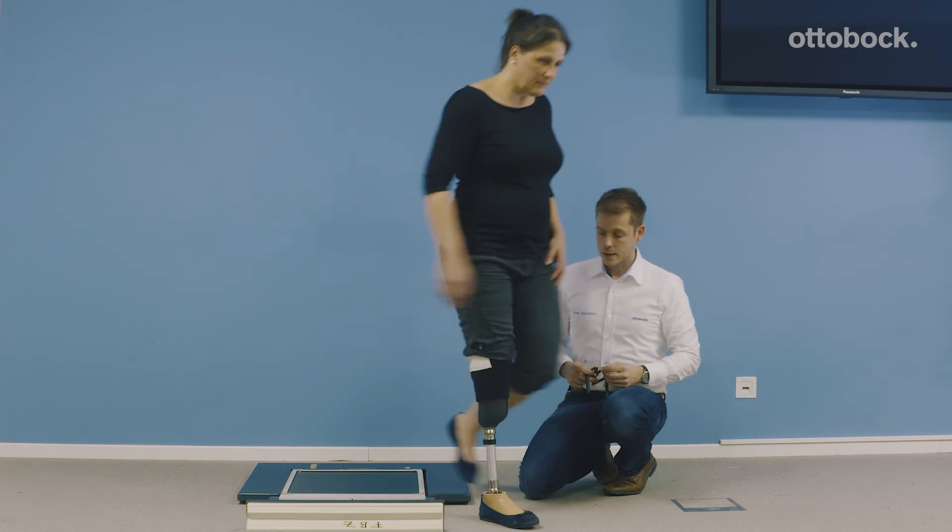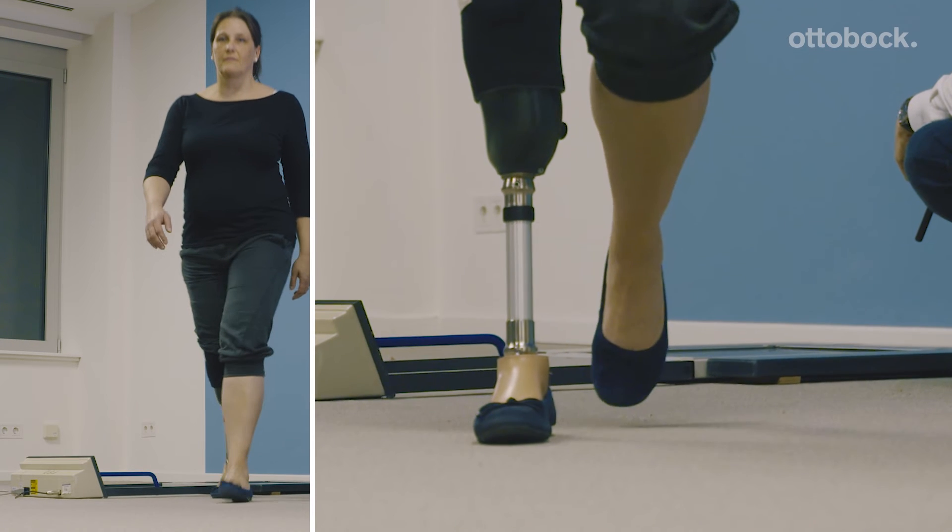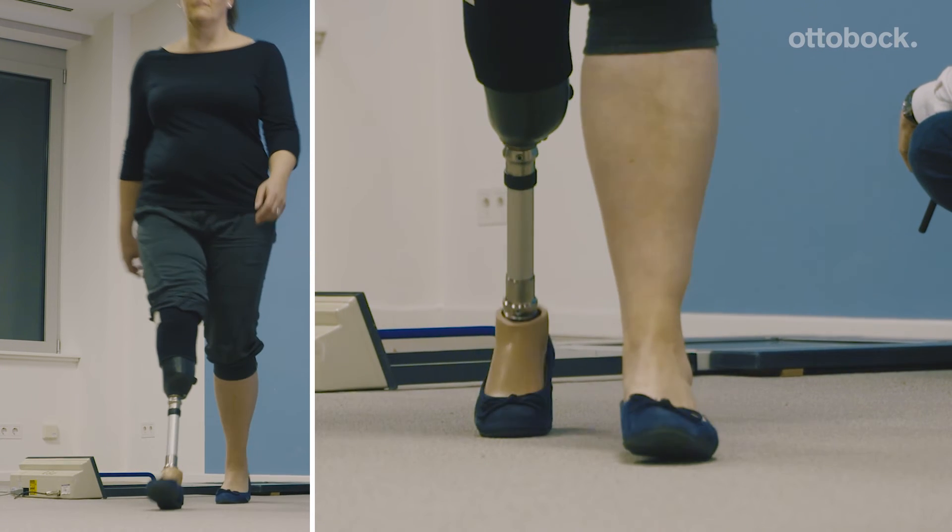Now let's see what happens when you walk. With the 5 degrees of external rotation, the gait pattern looks really fine.